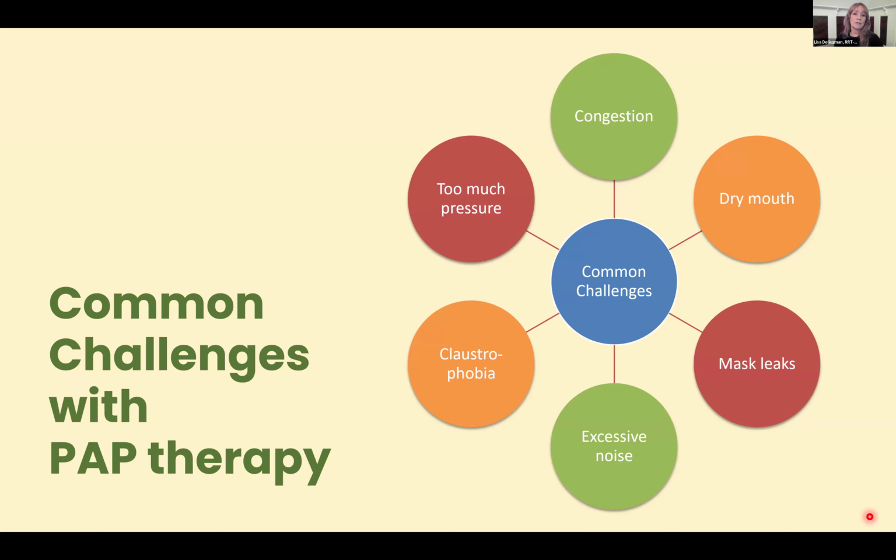And then too much pressure. So there's just patients that either always feel like it's too much pressure, or if we get to a therapeutic level that is actually opening their airways, if they wake up aroused, they just can't handle that pressure. So lots of challenges with PAP therapy sometimes.